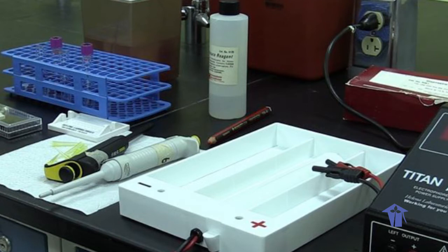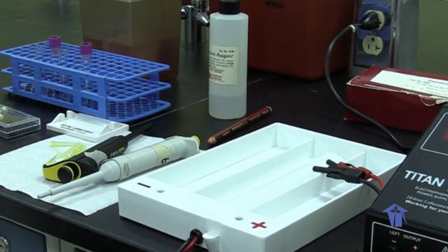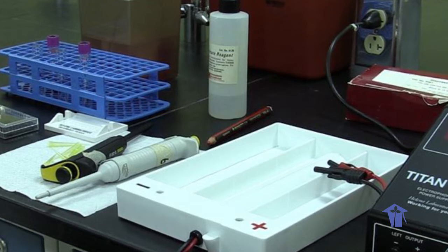That is one of the advantages. It has become the method of choice in many labs, particularly for large-scale population testing, such as neonatal testing programs to determine if the neonate, or the recently born offspring, has any abnormality in their blood, hemoglobin specifically.